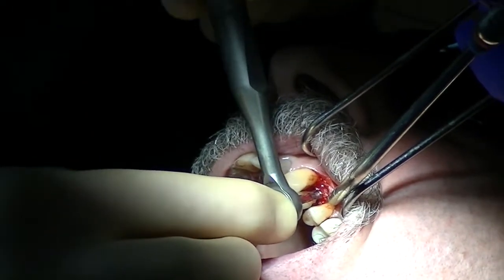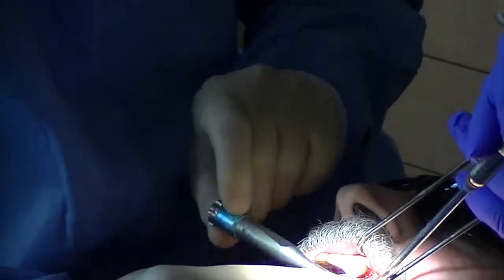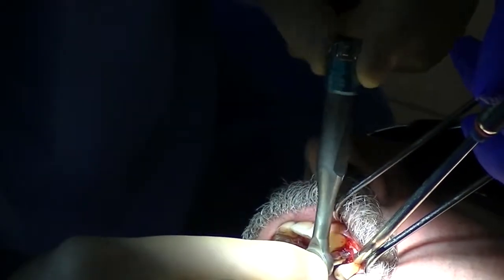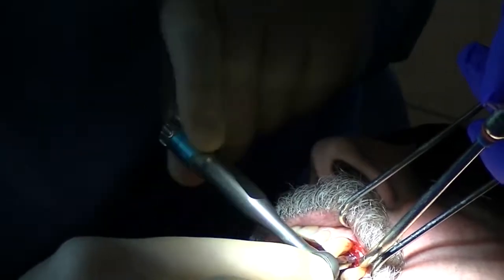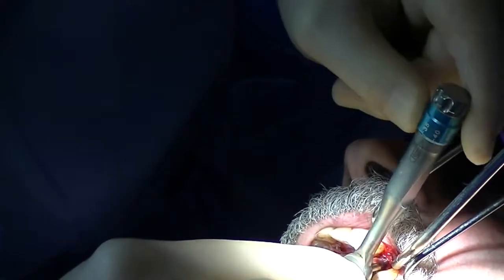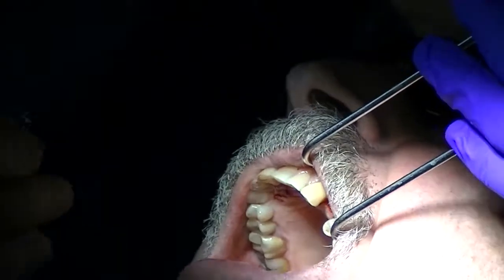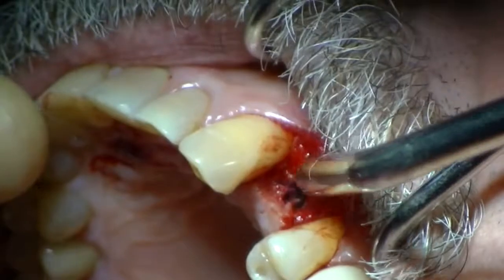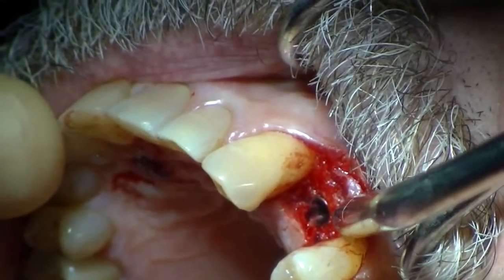So I'm now turning it up to 30 Newton centimeters. 9 o'clock, and it clicked again. 35 Newton centimeters. And it clicked again. So we're getting tremendous stability. Remember where we're getting our stability from? In the apical 2 millimeters. And it looks like we're in really good position there. We're right at the crest.